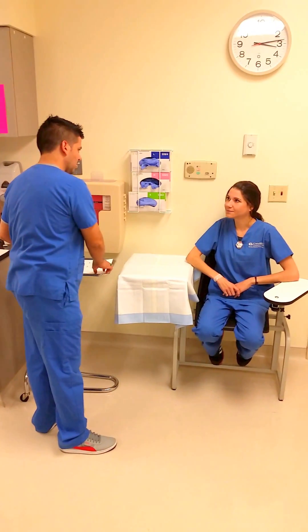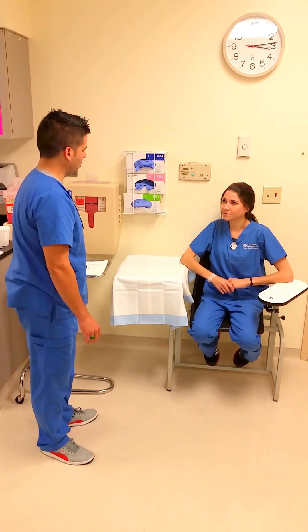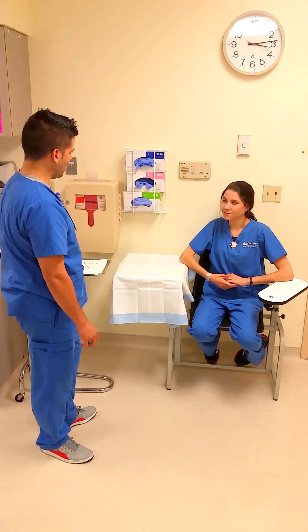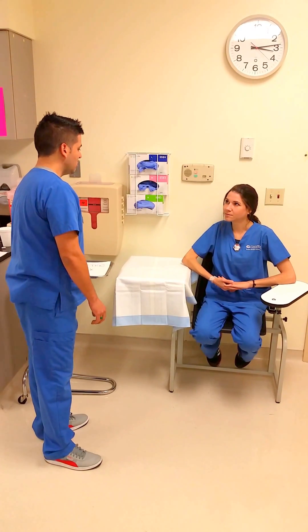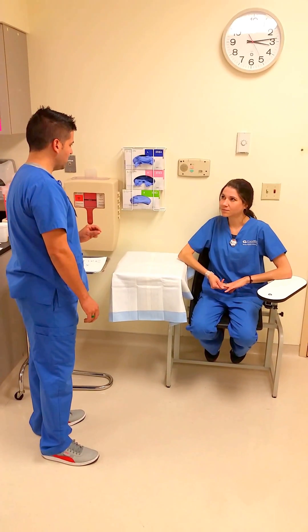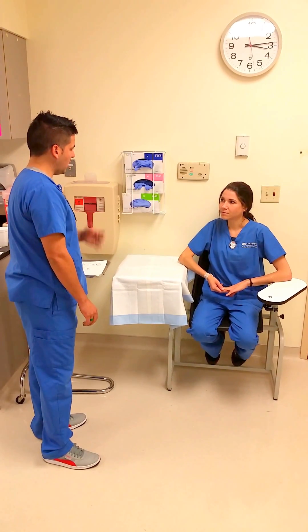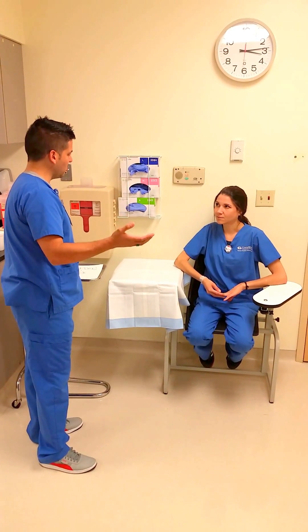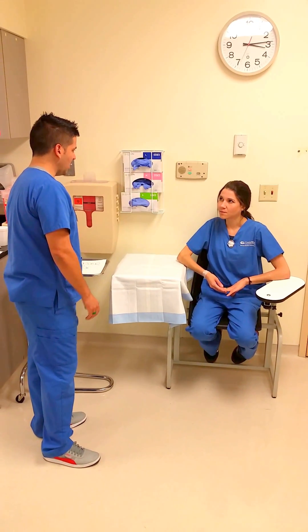So any chance you're going to be pregnant? No. Your doctor has ordered a thyroid uptake and scan so they can evaluate how well your thyroid is working and functioning. We do that by giving you a very small amount of iodine capsule pill, which will be taken up by your thyroid. We'll evaluate by taking a measurement from the uptake probe to see how much is in that tissue by your thyroid, and then later on you'll be taking images.